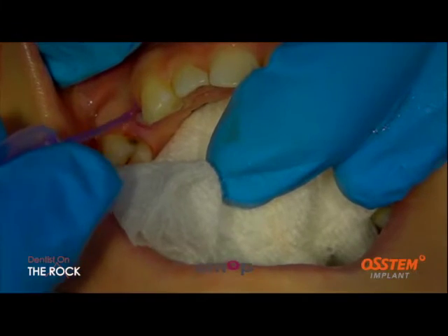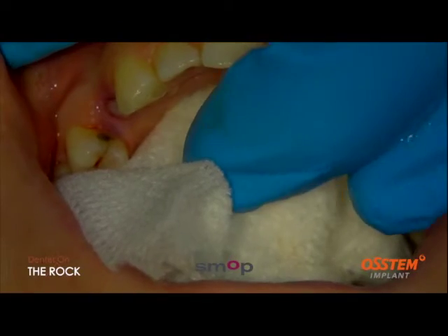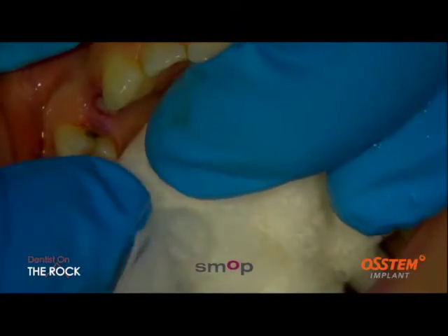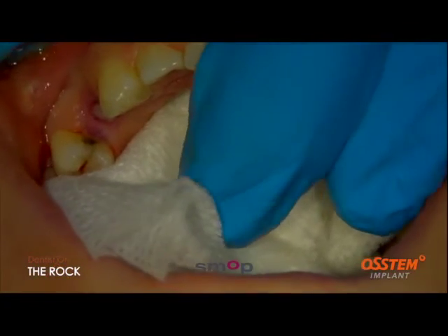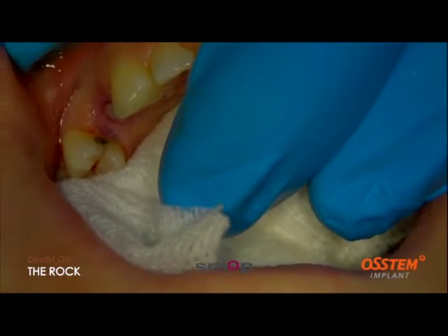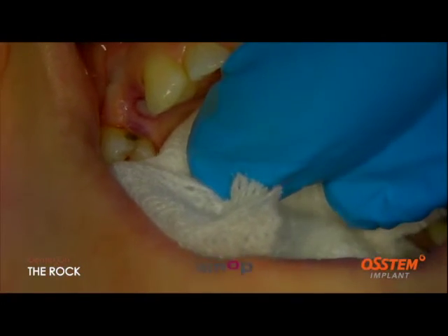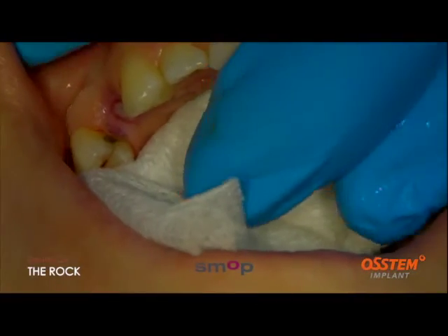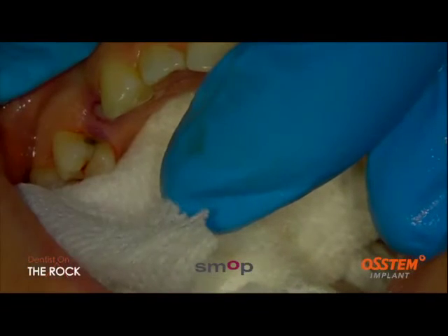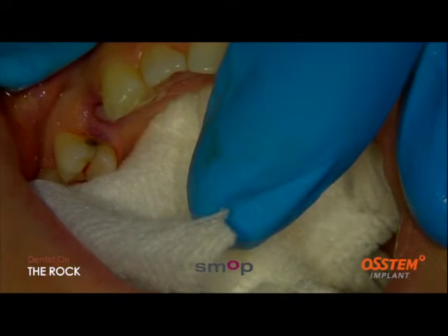And then I'm going to just leave that to seal. This takes about 30 seconds to set fully. And it forms basically a little scab, which drops off after a week or two. It's exactly the same chemical as superglue, cyanoacrylate, but it's the surgical form, the Periacryl 90, and you can get it from Henry Schein, and believe it or not, developed by the US Army in Vietnam.